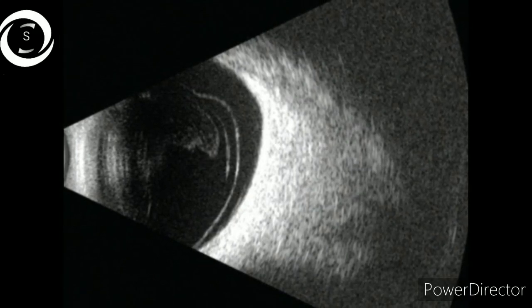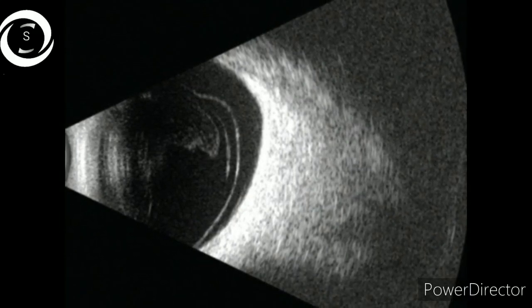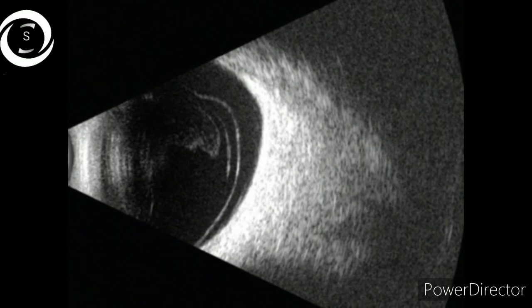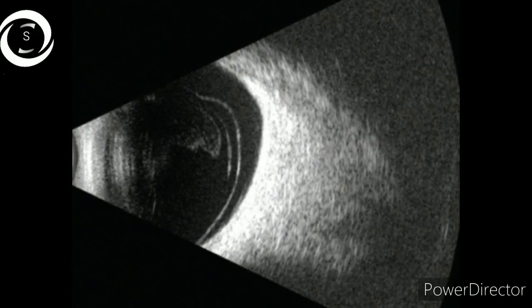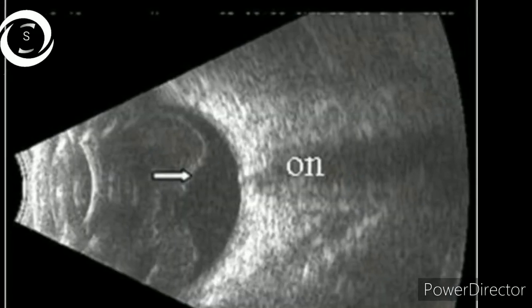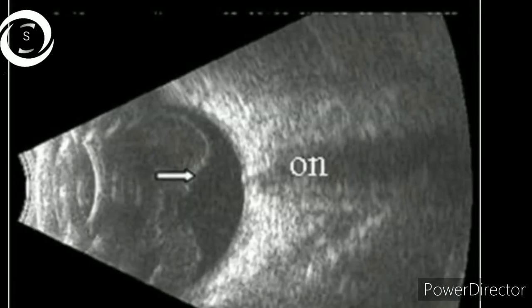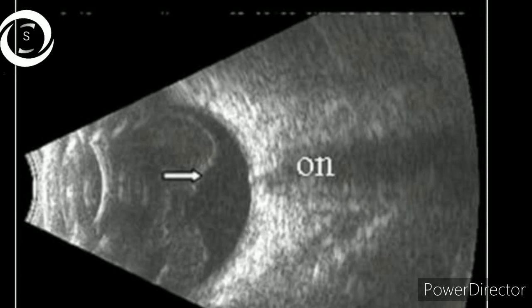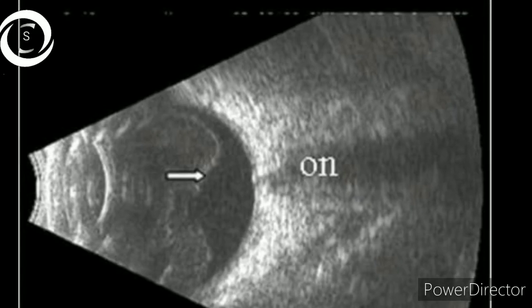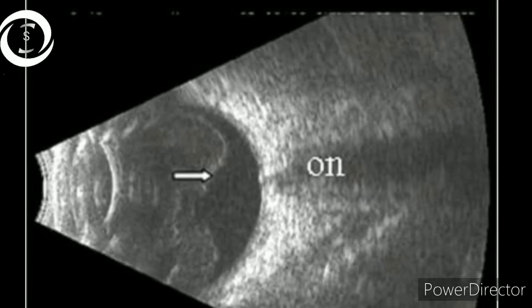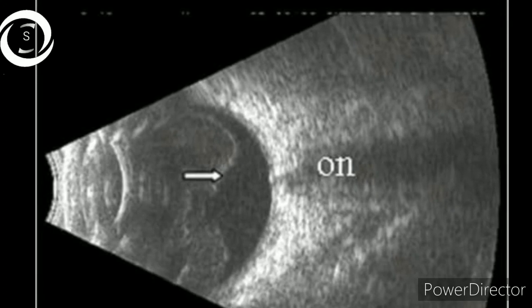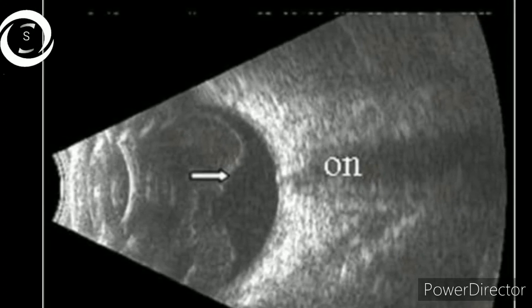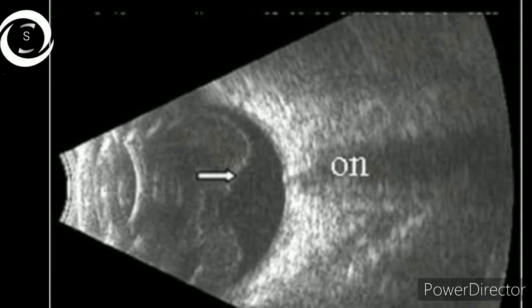In the second B scan, you can see complete posterior vitreous detachment — totally detached from the disc — with a thin linear hyperechoic shadow and subhyaloid hemorrhage. In the third B scan, the optic nerve is visible with complete PVD and condensed vitreous. PVD is less echogenic and disappears below 70 decibel gain.